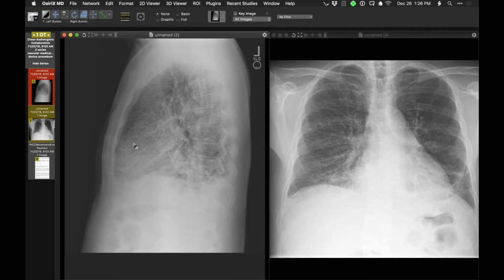So yesterday when I did a Google search, you can find a lot of comments on discussion groups involving the Society of Vascular Access. The folks that put these catheters in have a little community and they chat. They describe this as quite common, and they talk about how they all see flip cases and they inject them and they flip back down again. Sometimes, apparently, when they flip back up, patients report a swishing sound when something's injected into it, and that's a clue that it might be in the jugular vein. It's kind of interesting discussions you can read about those folks talking about flipping PICCs.